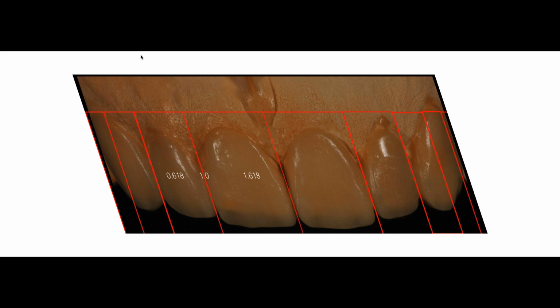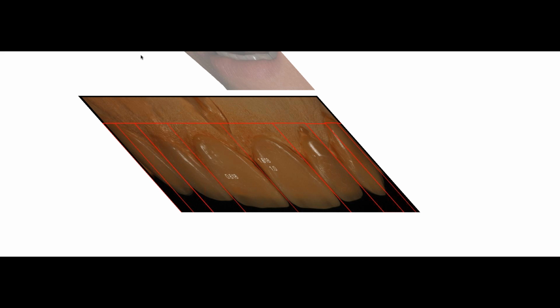Every single decision that we are making is based on our photos and our wax-up. We have not even tried this on our patients. We're just analyzing and planning. We're trying to put all the pieces of the puzzle together before we actually see our patient.